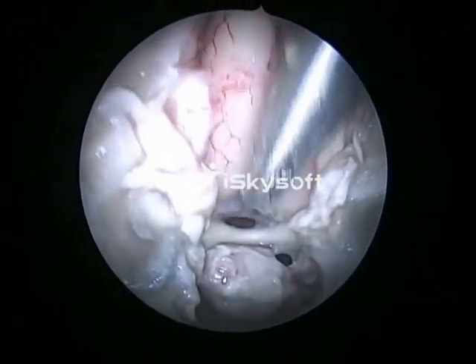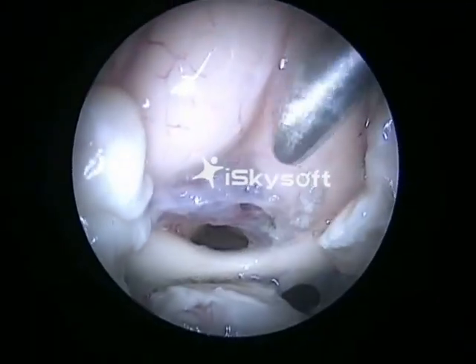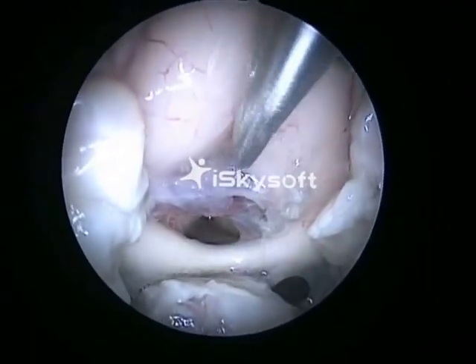And now we are trying to demonstrate the anterior cerebral vascular bundle.